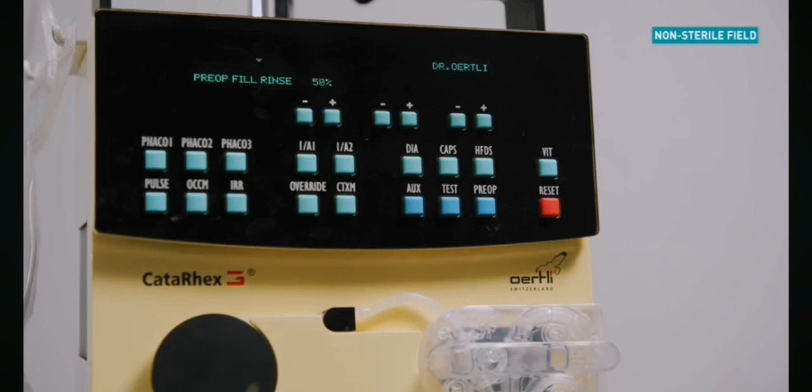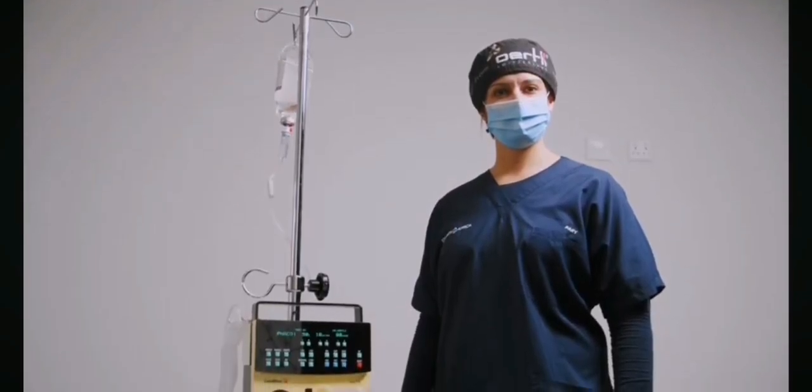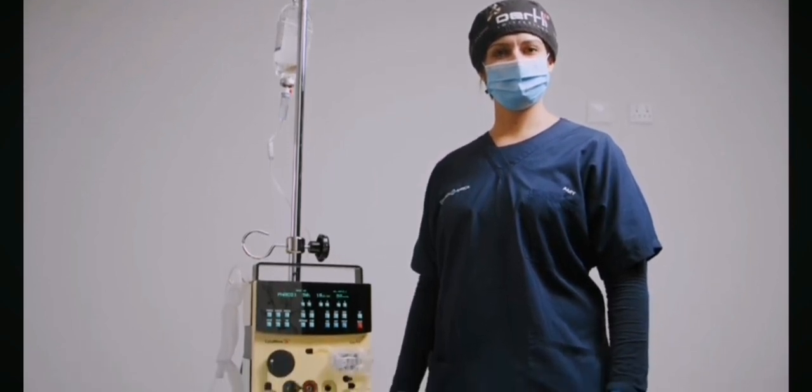The FACO test will start automatically after a complete pre-op cycle. Allow the machine to run through the cycle up to 100%. The device is now ready for surgery. Please remember that this is a basic guide for setup — refer to the Eartley user manual for complete instructions. Thank you.